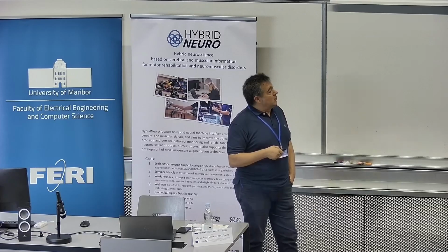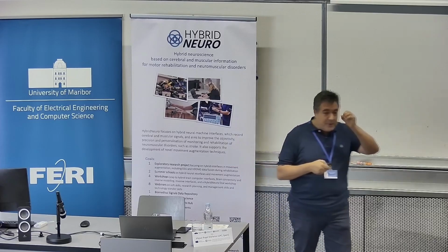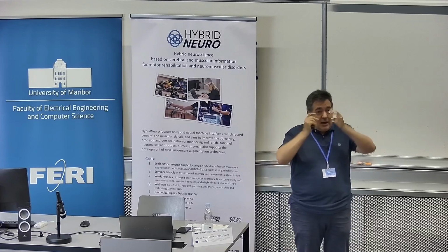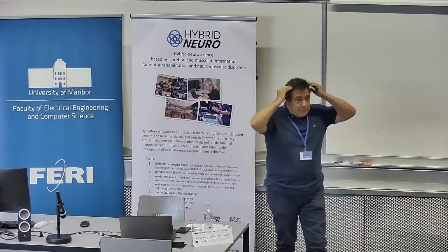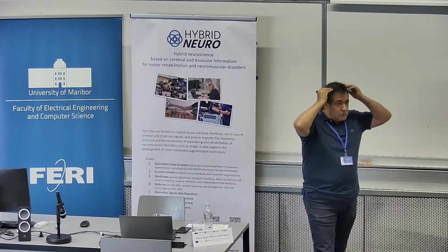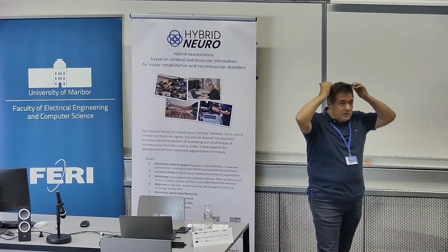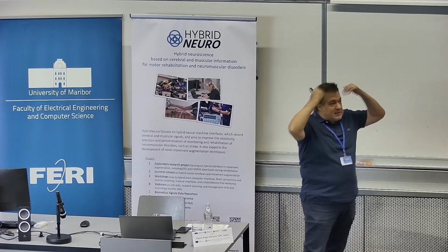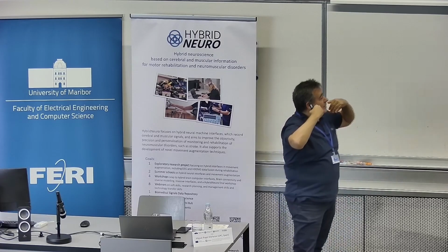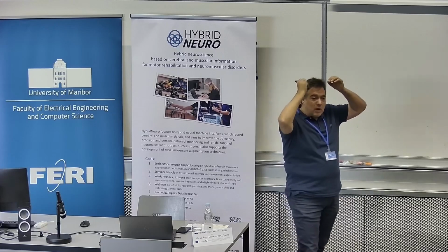When you have an activation, for example a dipole inside your brain, and this is propagated, and the activity arrives at different points of your head where you put the electrodes, it's not clear if the information is coming from one side to the other, or if it is from propagated potentials, not from potentials going from one point to another one.